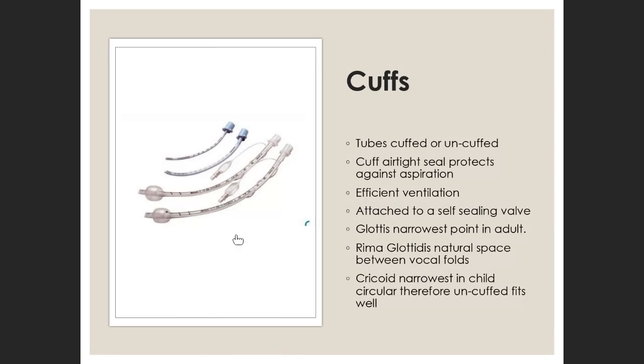All right. So these are the endotracheal tubes. These are the pediatric ones. Notice they're small. Yeah, this is a slightly bigger tube. These are uncuffed, they have no cuff. And then these are for an older child, say 10, or a small adult, maybe, and they have cuffs on them. So what's the purpose of the cuff?